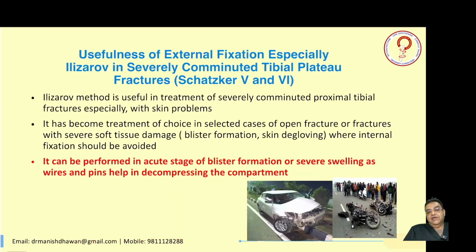The surgery can be performed in acute stage of blister formation or severe swelling, as wires and pins help in decompressing the compartment. Now this is the main benefit of Ilizarov. Now if you have to do the plating of this fracture, you have to wait for 3 to 4 weeks before the skin condition settles down, and then you can do the plating, but it is not the case with Ilizarov. It can be done acutely. Now this is also a choice of treatment in infected non-unions.